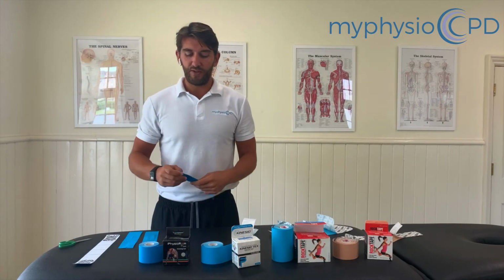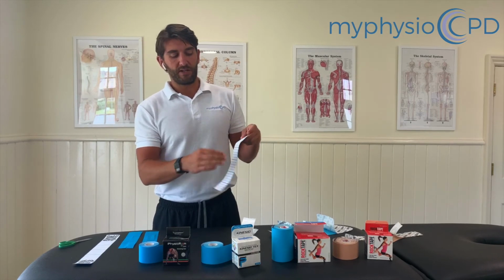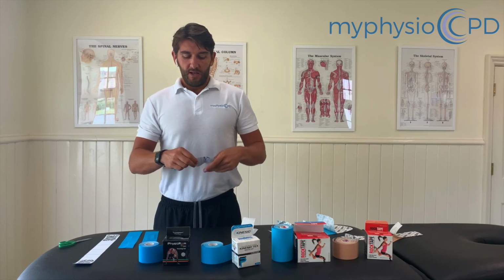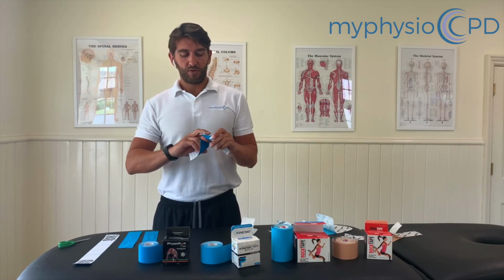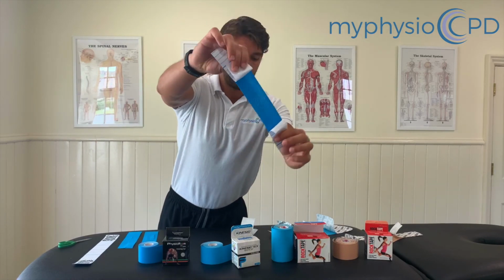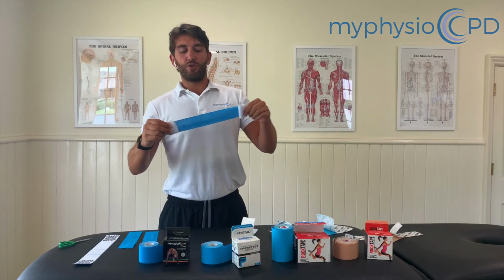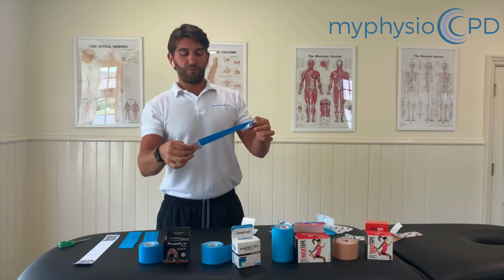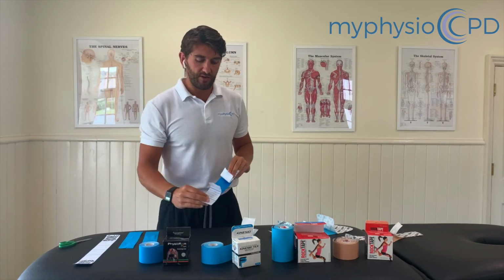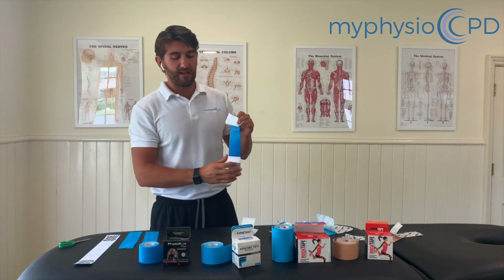So moving on to the Physio Room. This is the cheapest of all of the tapes. On the back, we've got the horizontal markings. There's no longitudinal markings, but I think you can work that out yourself. And if we open it up, it's nicely made tape, to be honest. On the back there, we've got the same kind of wavy markings. They look very similar, really. It's got a good amount of stretch to it, and it's pretty well made, to be honest. It's pretty similar to the Kinesio Tex Gold tape here. Maybe not quite so well made as the Rock Tape.